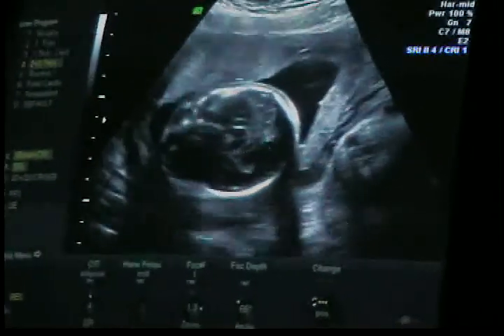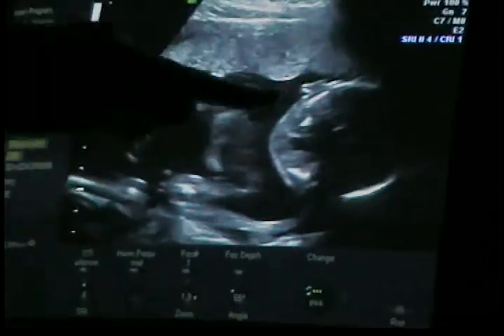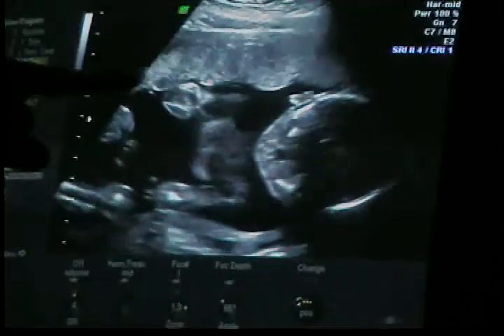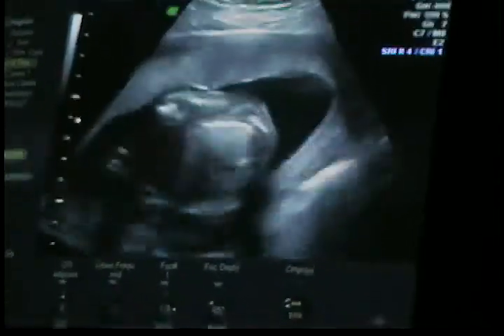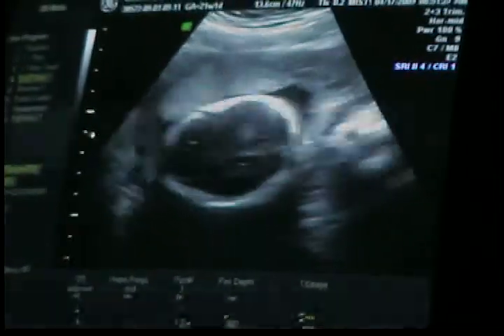You should soon. What you have too is an anterior placenta, which basically is a padding between your uterus and baby. So when baby kicks, it kind of kicks the placenta. So anyone that has an anterior placenta usually feels movement a little bit later on. I'm going to measure the top of our head here.